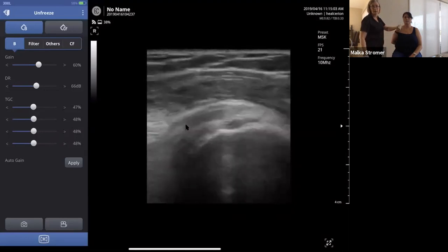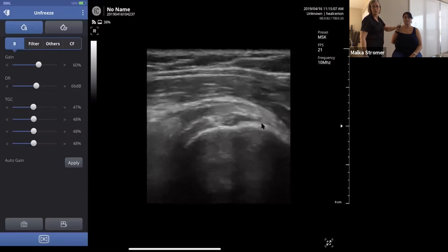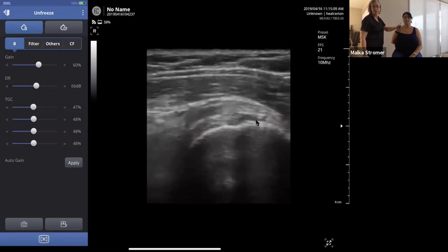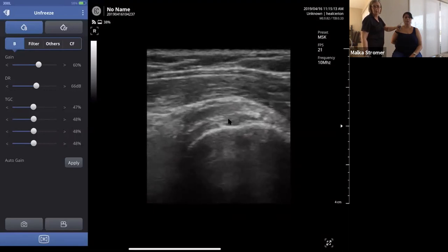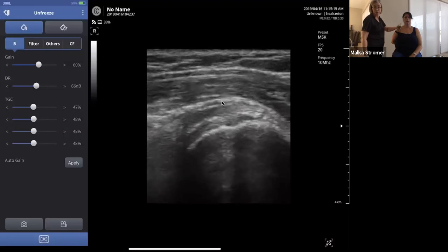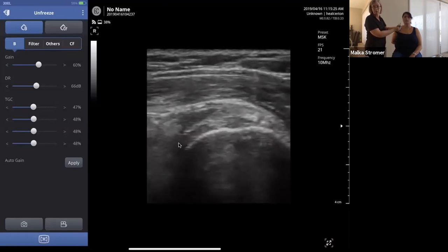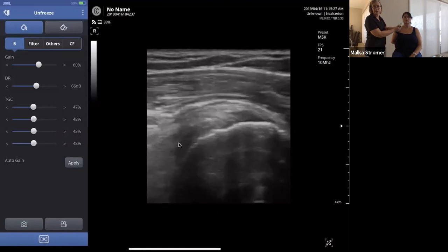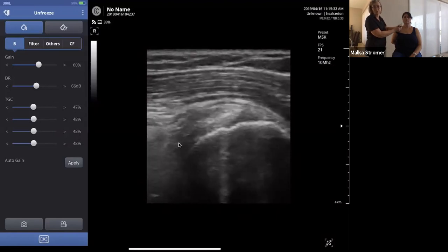You have the greater tuberosity right through there. The tendon is above it. And bursa is the little black space higher, right there, in between the subdeltoid fat and the tendon. Now that is a really little space. It's considered a potential space. So if there's no fluid in it, you're not going to see anything. And fortunately, she has no fluid in there. So we're finding good news for her all the way around.